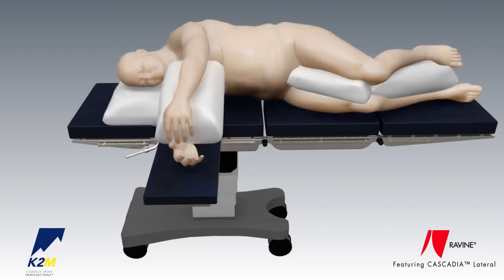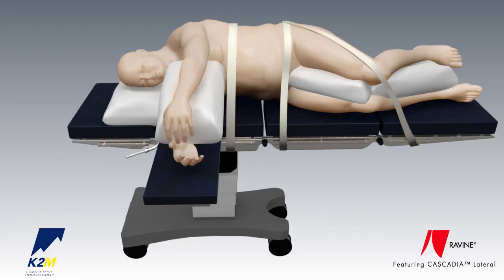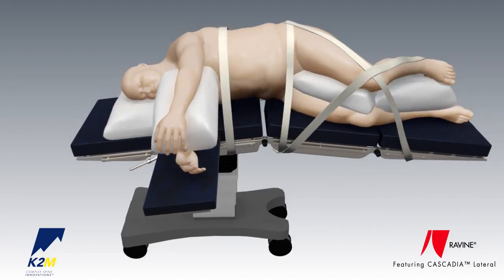The patient is placed in the lateral decubitus position with the iliac crest directly over the table break. Tape is placed on the following regions to secure positioning: just below the iliac crest, over the thoracic region, from the iliac crest across the knee to the table, from the table to the knee, over the ankle, and to the table. Care should be taken to prevent any undue pressure points.